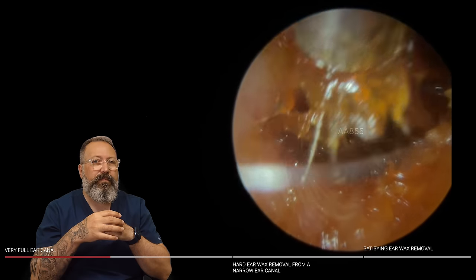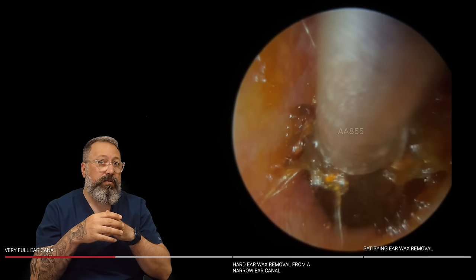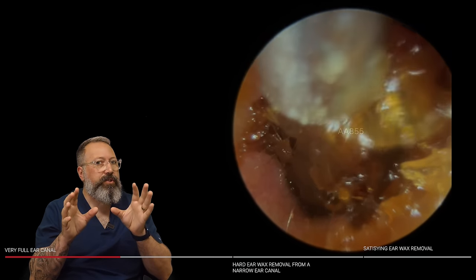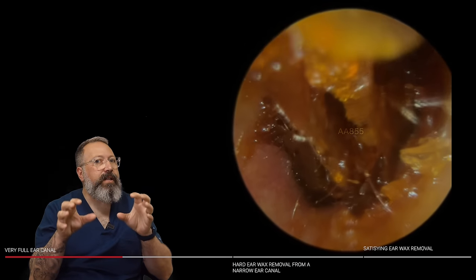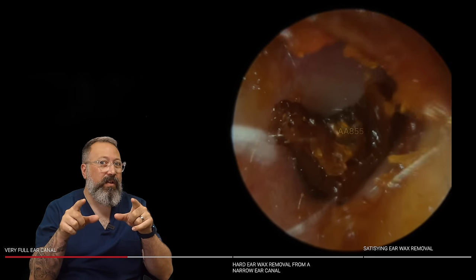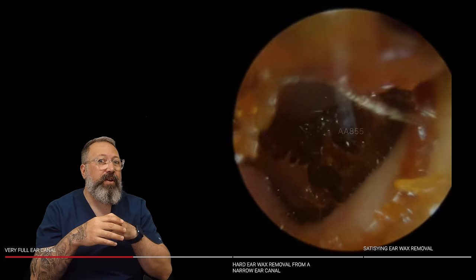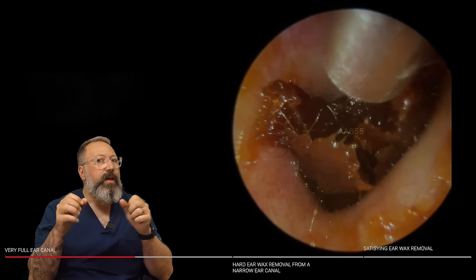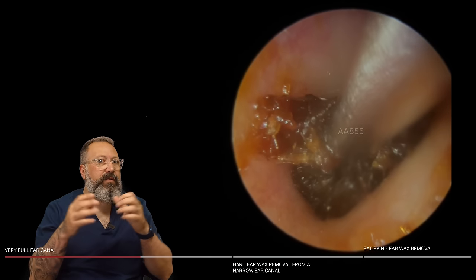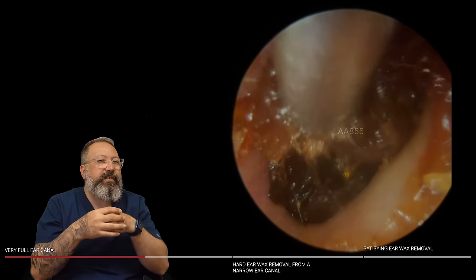There we go — lifting away. You can see just how tacky that is. As I'm pulling edges of it, it doesn't want to move. So I'm just pulling the other edge here, trying to lift. Now this is always something you've got to be a little bit more cautious about because this wax is super duper sticky in the anterior recess. You can see a keratin ribbon running all the way through this as well, so it's right down in the recess, which means we ideally want to take this out as cleanly as we can.